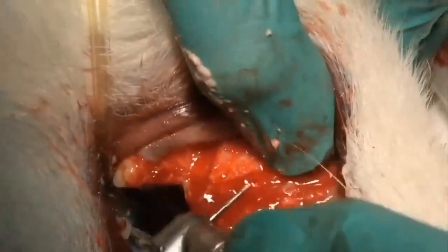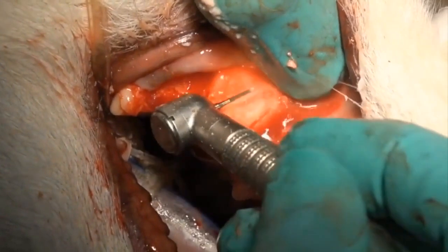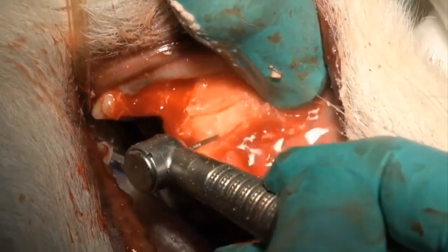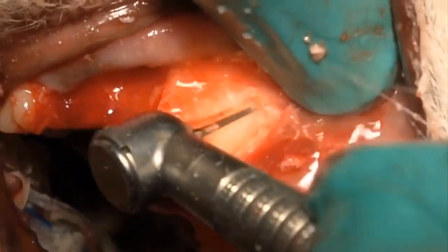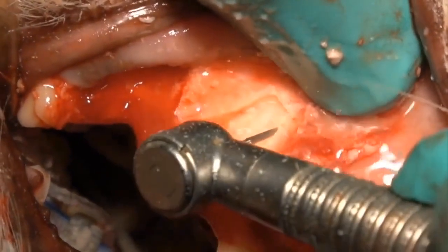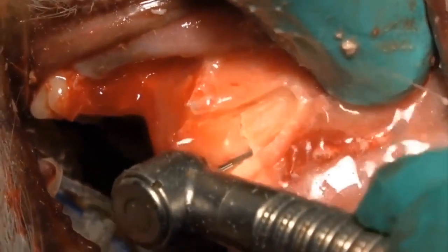What we need to do is come back here with our cross-cut tapered fissure burr and remove more of the vestibular bone, increase the groove depth on the distal and the mesial aspect. And as you see there, we're kind of going up underneath on the coronal portion of the root tip just to release it from the bone a little further. Once we complete that, we'll be able to come in with our luxator and remove it.